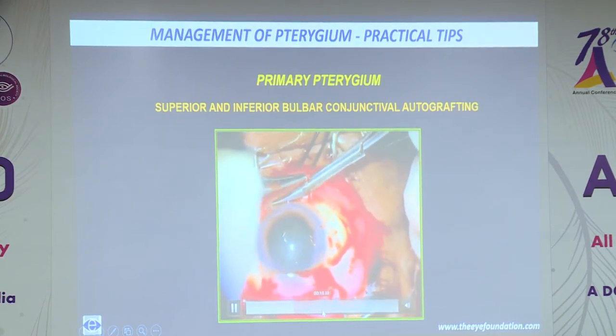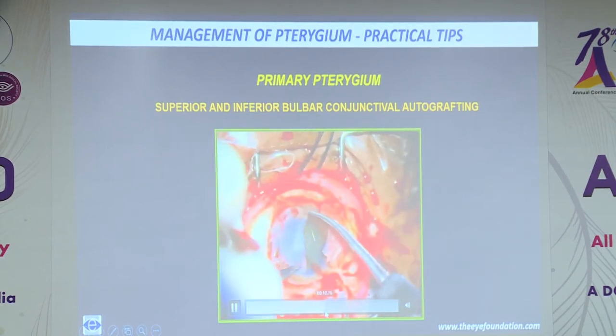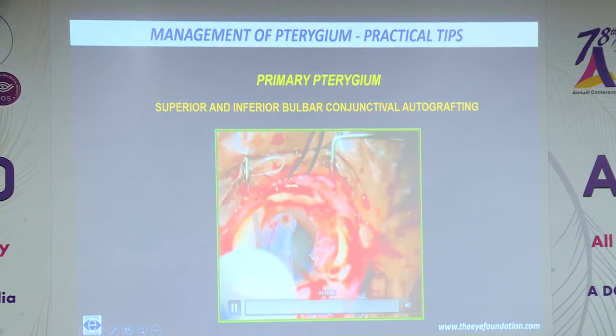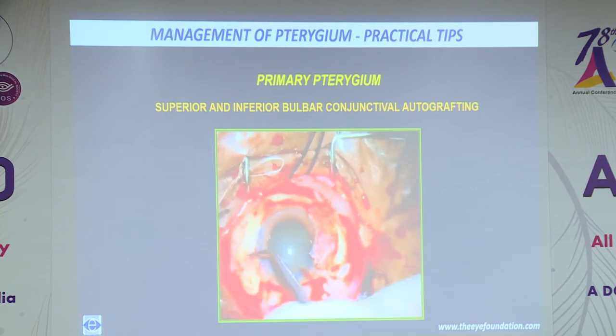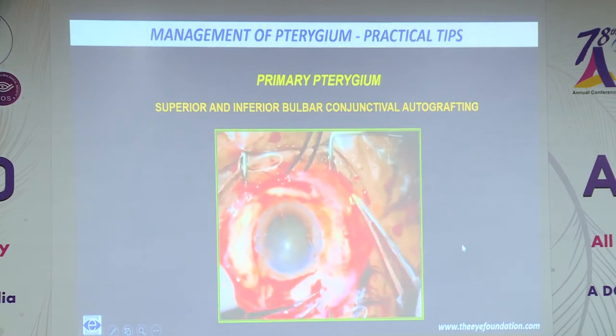So this is a demonstration of a superior and inferior bulbar conjunctival graft. It's a little difficult to obtain a graft from the inferior bulbar conjunctiva, but it can be taken. There is a tight adherence of Tenon's to the conjunctival tissue there inferiorly.